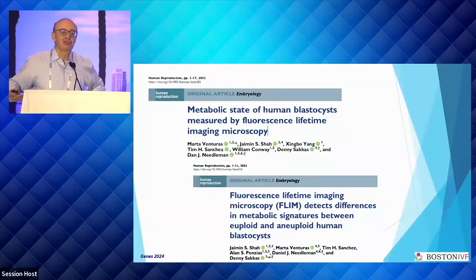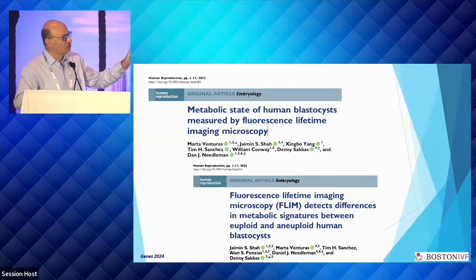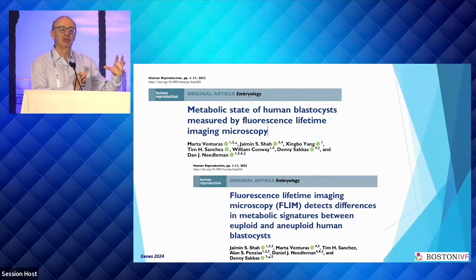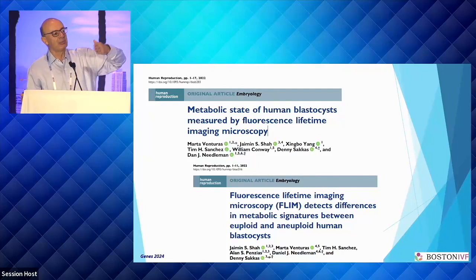There are some other technologies we've been working on for many years. We've been doing this for a long time. And some of the things we've been interested in and we can look at non-invasively are things like the metabolism of the embryo. And we've put a lot of work into this over many years. This is just 2 papers that we had published using a technology called fluorescence lifetime imaging microscopy. This technology, it's not just looking at the brightness of the embryo, it's actually getting much more information using fluorescence. So the clue is in the lifetime imaging, whereas when a pulse is sent by the laser, you can actually measure the time it takes to come back and excite the actual photons.